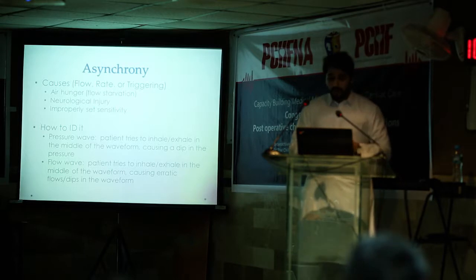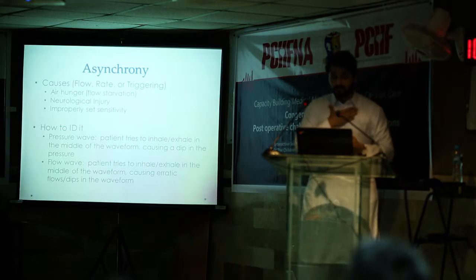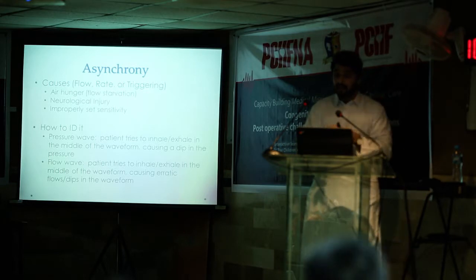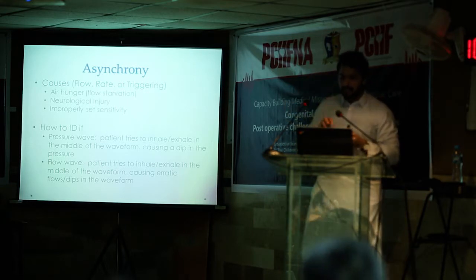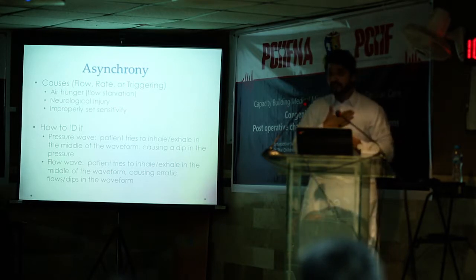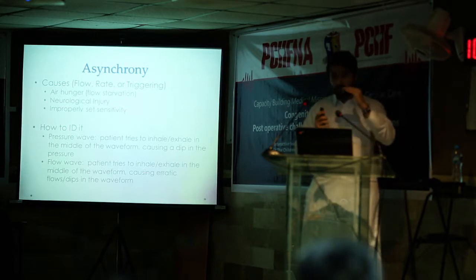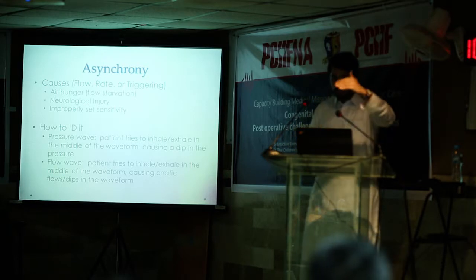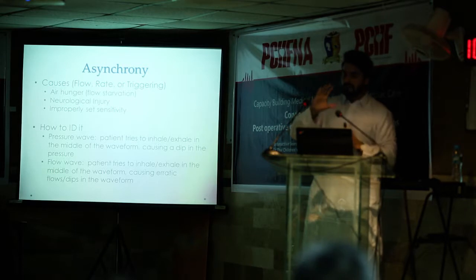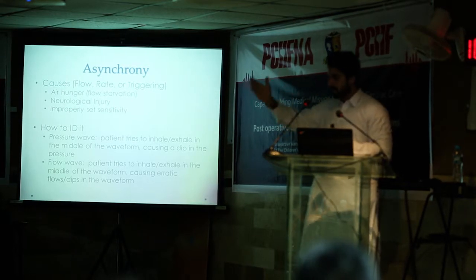Asynchrony. For me, it's one of the most important things. And I do believe sometimes the doctors themselves underestimate this. They think asynchrony is fine. For me, it's a big deal, because if the patient is asynchronous with the ventilator, he will not get the volume, because he should get, for example, 14 breaths per minute.